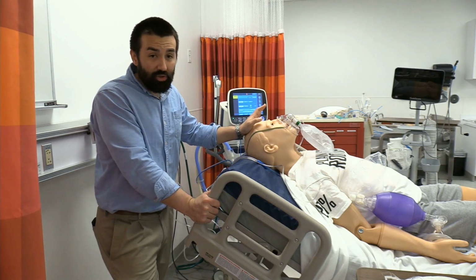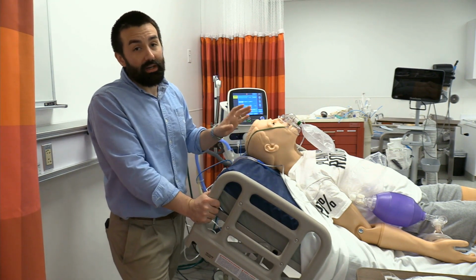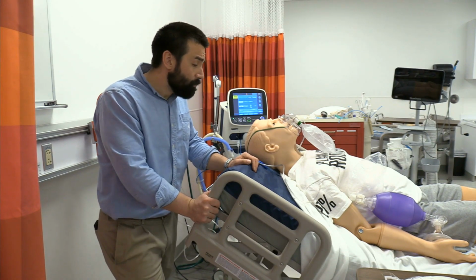Keep in mind, we're going to be giving drugs and stopping this guy from breathing, so that's why we're trying to hyperoxygenate. We're trying to give ourselves a little bit of buffer of time that allows us not to be in such a sense of urgency trying to place that tube.